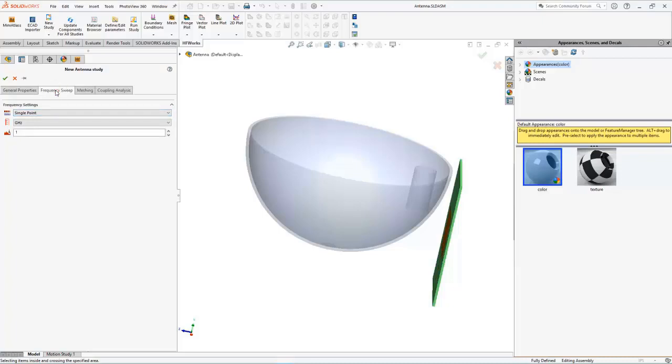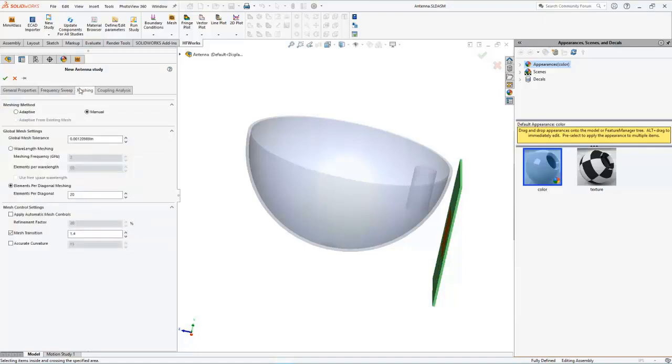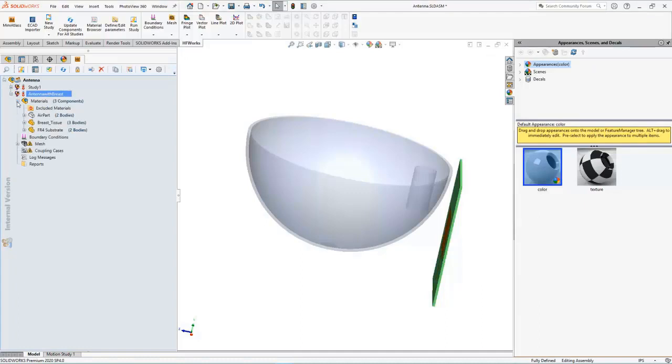Then enter the frequency settings. The settings include the frequency range as well as the choice between solving the model for all frequencies in a discrete sweep and using a reduced order model in a fast sweep. Under the meshing tab, you can choose the meshing technique, either manual or adaptive, and enter meshing parameters. I also want to highlight what I mentioned about the thermal coupling. If you want to do thermal coupling, you just turn on the thermal coupling feature. After defining all study properties, the simulation process is in three steps. The first step in analyzing the antenna is to apply material to all of the bodies used.